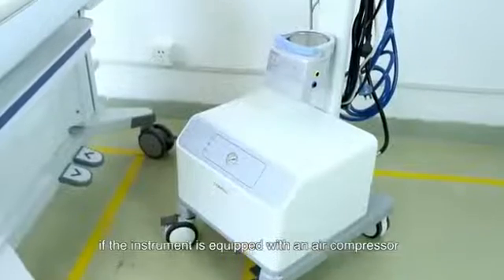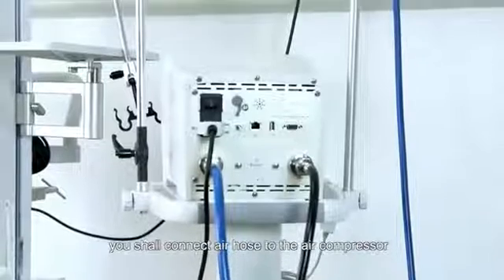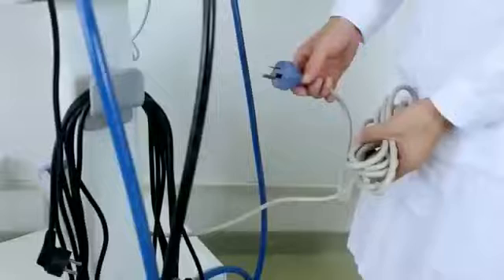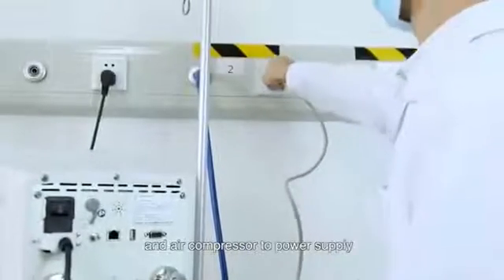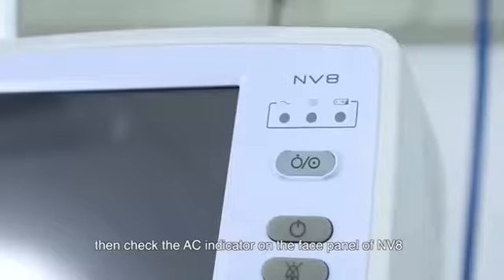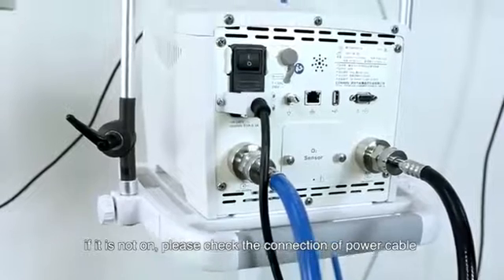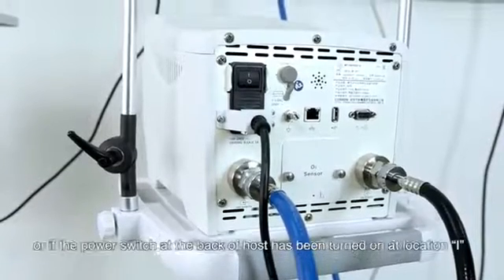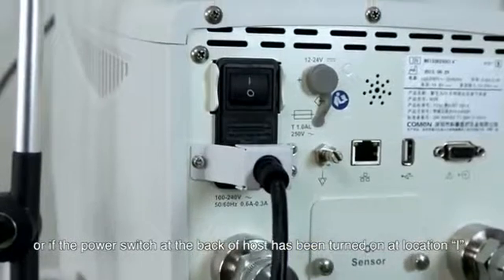If the instrument is equipped with an air compressor, you shall connect the air hose to the air compressor. Connect the main machine, heater, humidifier, and air compressor to the power supply. Then check the AC indicator on the face panel of NV8. If it is not on, please check the connection of the power cable or whether the power switch at the back of the host has been turned on at the location I.